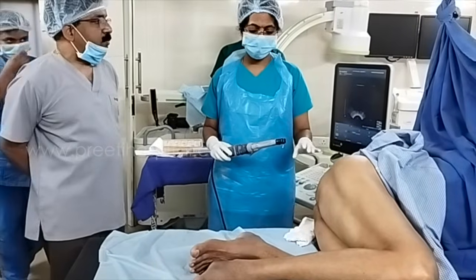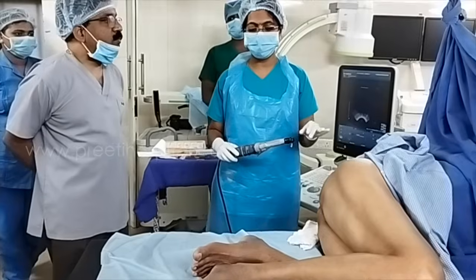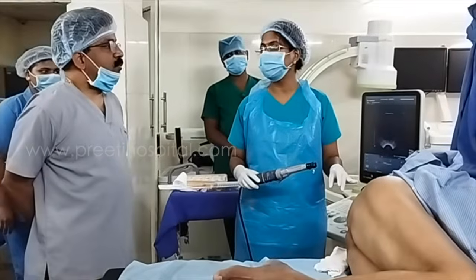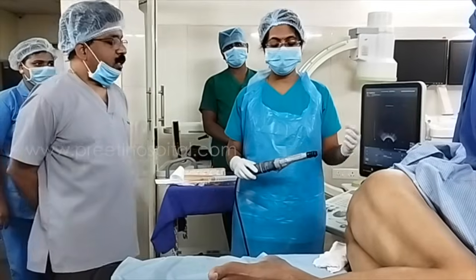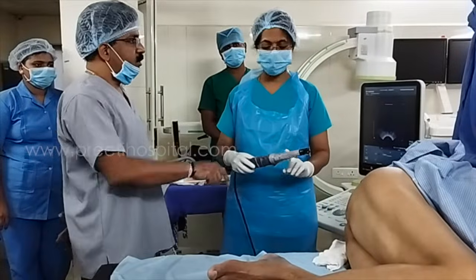If the patient does not tolerate the procedure, then we can plan for a local block, which we do with the PCNL needle. Can the PCNL needle be used through this? Yes, we can use it through this.